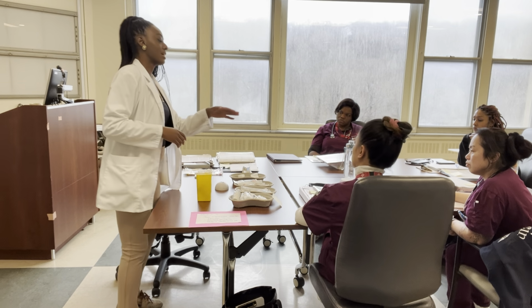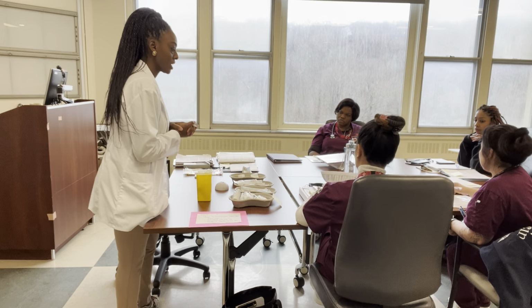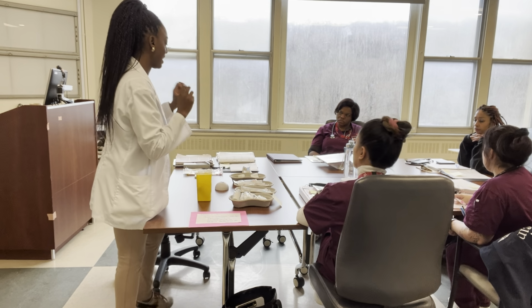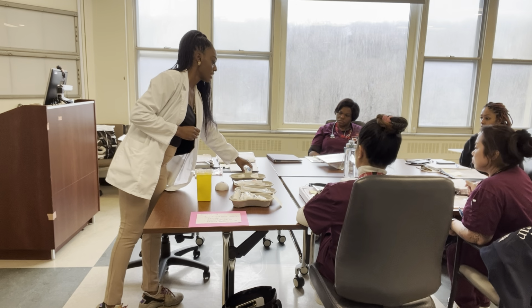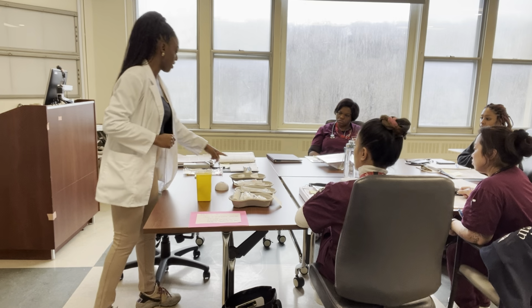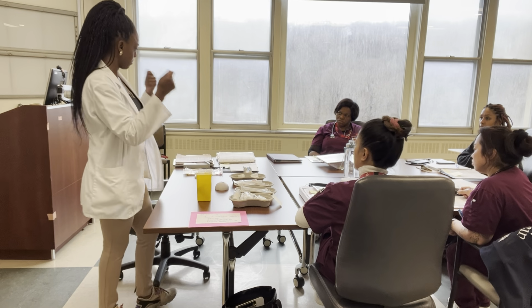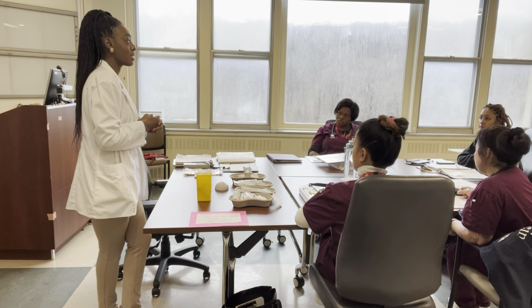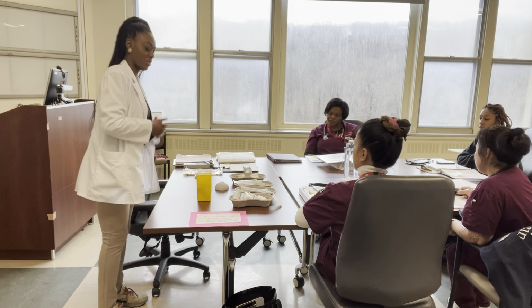I'll give you the time of day, you'll use the protocol, and then you'll just pretend like this is that type of insulin. Okay, so I'll try to pick one that's not mixing. If I'm able to, I'll get a second vial, and then you can actually have two if you need to. It's for you to decide, dependent on the type of insulin, right? That was part of your homework.